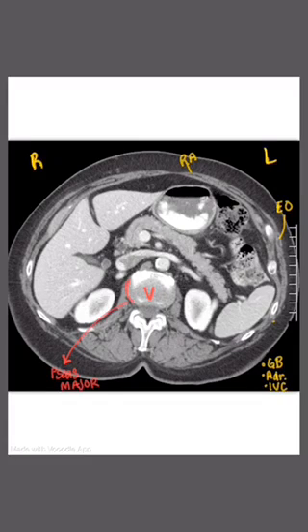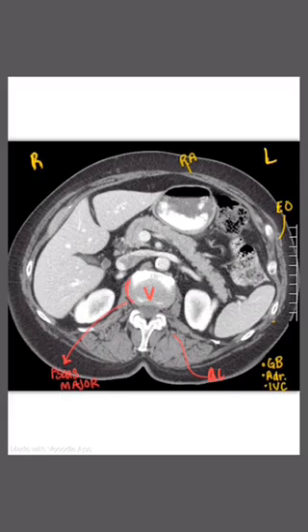And then lower than that is the quadratus lumborum — that's a Q, y'all, that's a Q.